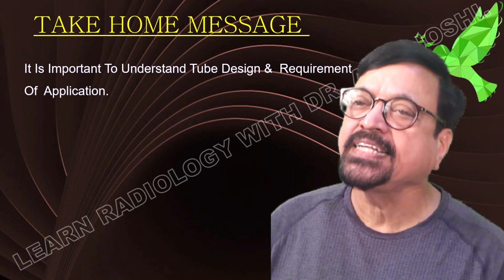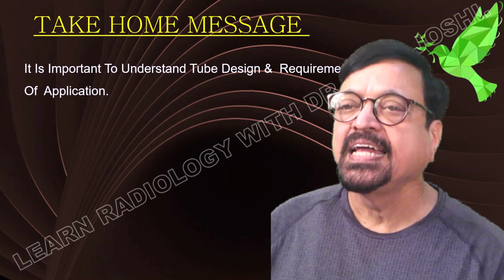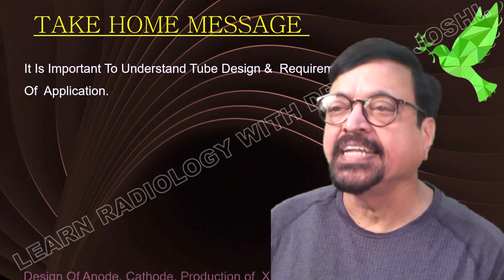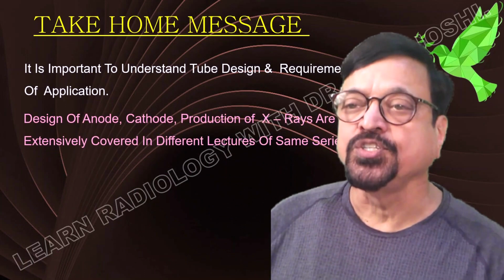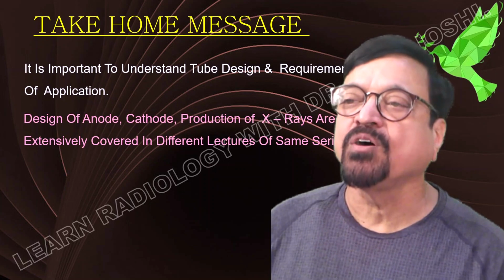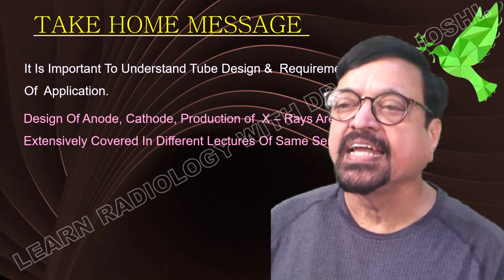What is the take-home message? It is important to understand tube design and the requirement of the application. What application, how much heat dissipation you want, that determines your tube design. Design of anode, cathode, protection, and production of X-rays are extensively covered in many lectures.